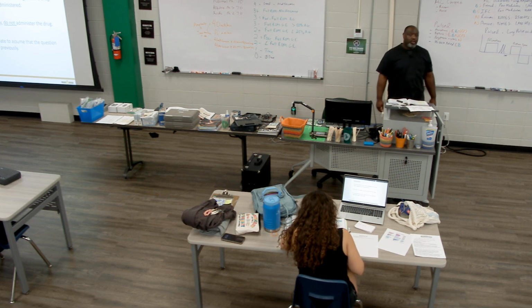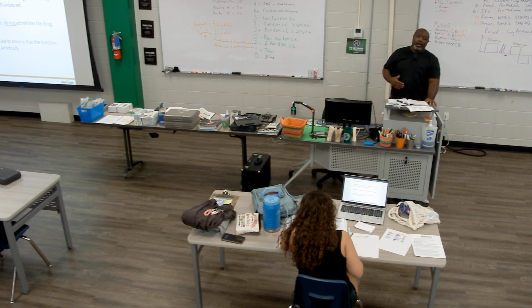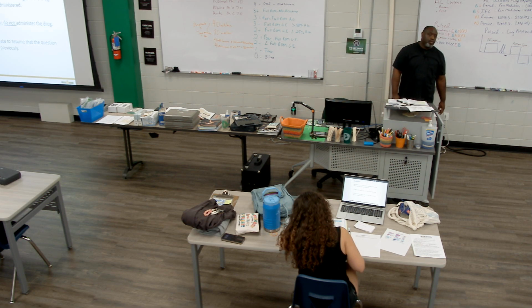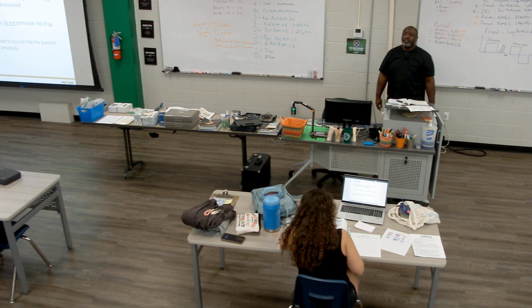So things I'm trying to do, like medial and lateral epicondyles for epicondylitis, some stuff on the wrist, if I'm finding that. Biceps tendonitis, you'll get it right over there. People do a lot of biceps tendonitis with it. I'm trying to think of other ones that I see or have done. A lot of upper extremity stuff. Heel cords, maybe over the heel cord itself. People like to do heel cords.